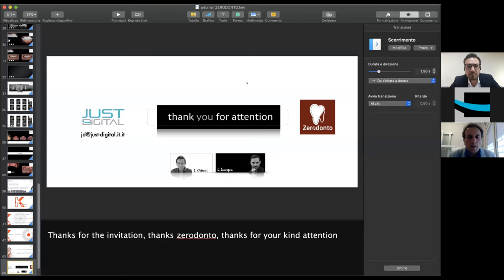Okay, for the colleague about the zirconium bar. I don't believe in the zirconium bar. I'm so sorry. I know in the international literature you can find it, but in all my patients, I prefer not to use the zirconium bar. In overdenture therapy, no, I can't use it, because I think you can use different materials if you don't want to use metals.